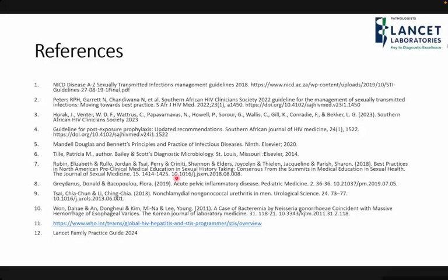Okay, so with molecular assays, you won't get any sensitivities, unfortunately. The only place you can get sensitivities, which we don't do, is research laboratories. Research laboratories will map out the whole gene and compare it to the reference strain, and they will know from what they've mapped out. Let me give you an example with fluoroquinolones: we have the gyrA and gyrB genes. We know if there's a mutation there, your fluoroquinolones will not work. And the same with all the antibiotics. We know if there's a mutation or beta-lactamase production, certain antibiotics will not work.